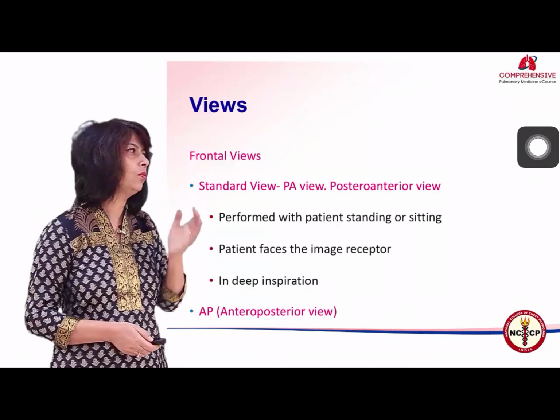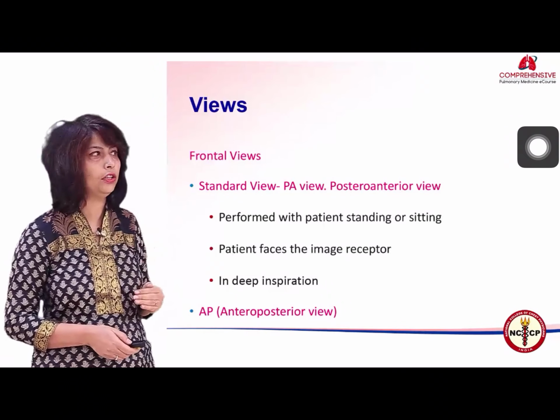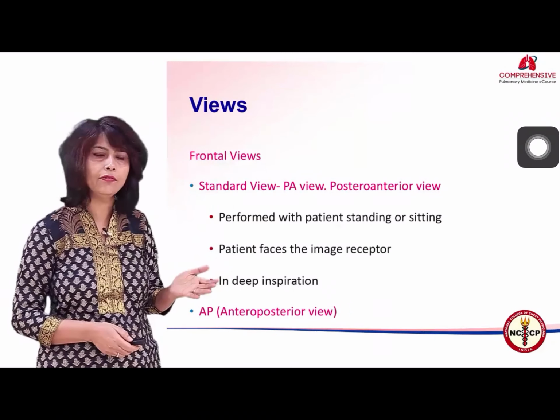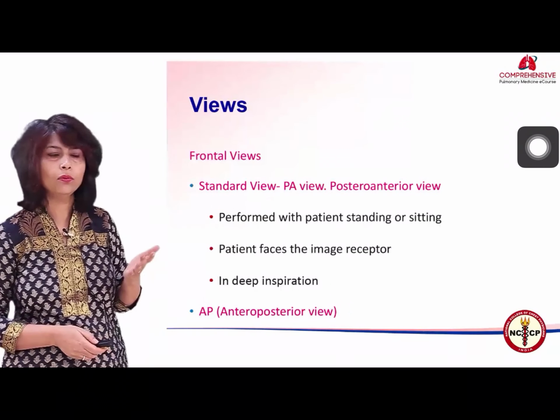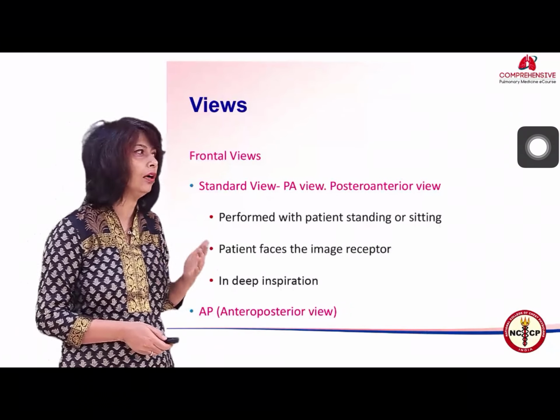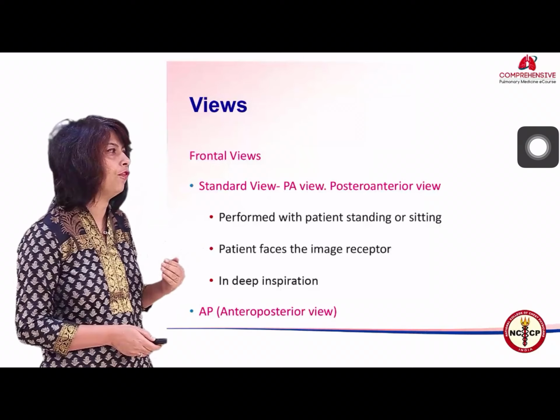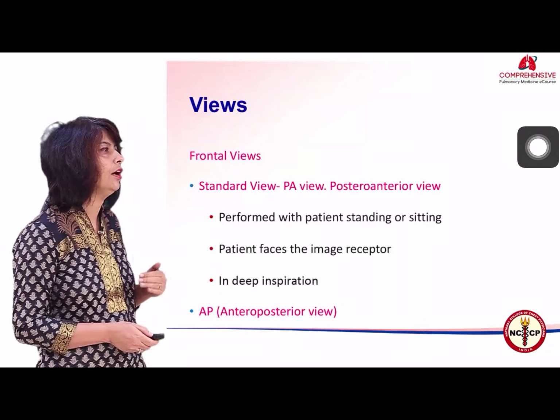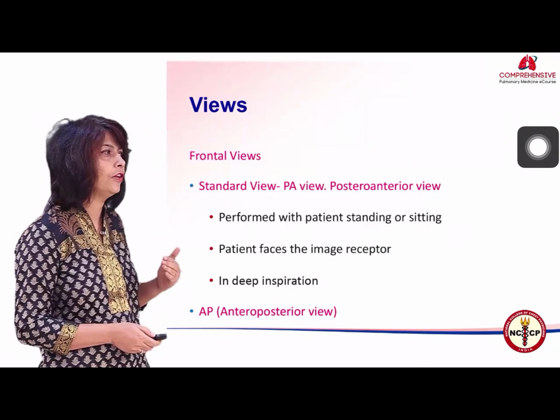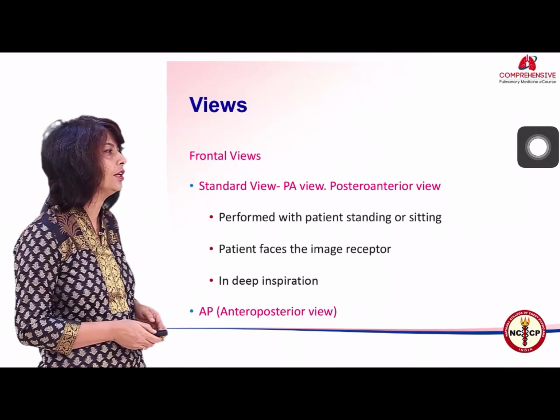Now, what are the views we would like to take? The standard view, as it is called, is the frontal view. The rest would get labeled as supplementary or ancillary views. However, in several parts of the world, a lateral chest radiograph is counted as part of the standard view. As we know, a frontal radiograph is performed in a postero-anterior projection with the patient standing or sitting and facing the film, or today as we call it, the detector. So, that is referred to as the image receptor.